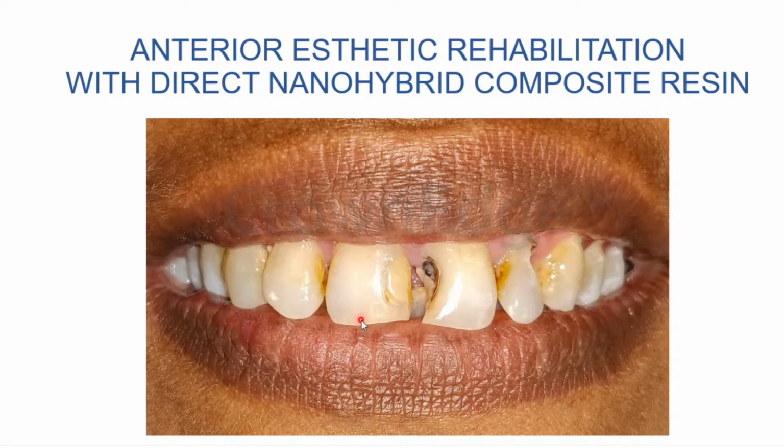So let's see what can be the different options. I gave the options of ceramic veneers. I gave the option of a little bit of orthodontics followed by restorations. I also gave an option for a crown with respect to 2-2, and these different options of ceramic veneers, crowns, and all that were discussed with the patient. The patient's consent was obtained, and the patient was looking at a more economical kind of an alternative, which can be done in a single visit or two visits with minimal intervention of the healthy tooth structure.